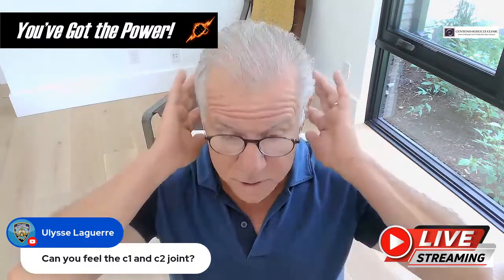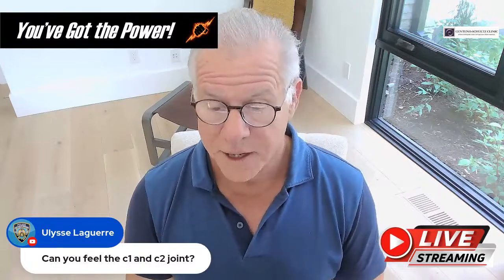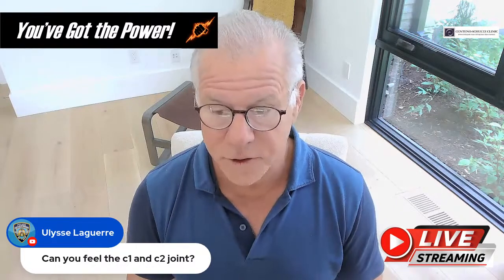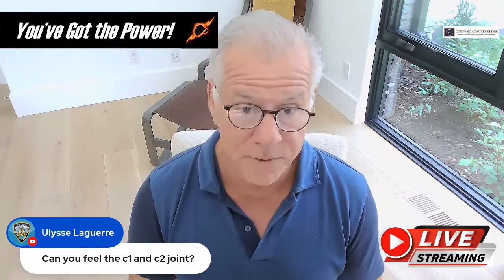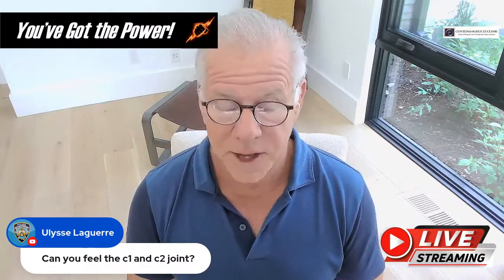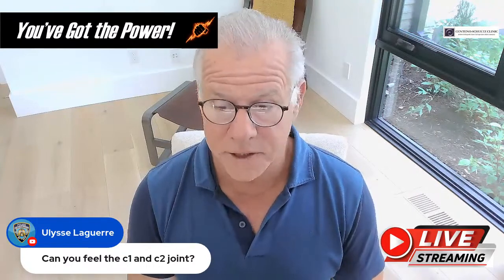And the doctor goes level by level. So for instance, I use a scribe. Carla is my scribe currently. She's being replaced as my scribe by a new scribe, but she can tell you, I will call these out: 0, 1, 1, 2, 2, 3, 3, 4, 4, 5, 5, 6, 6, 7, so that we can get an accurate map of which joints are symptomatic.